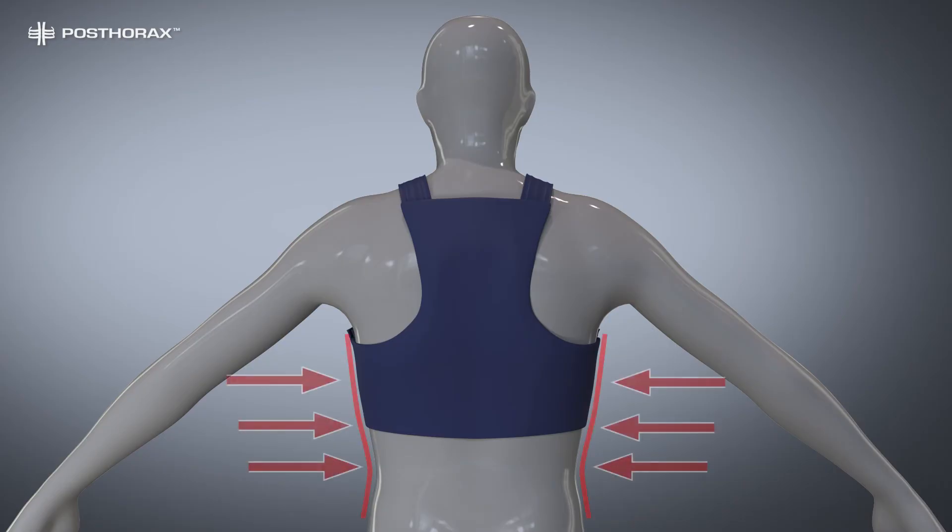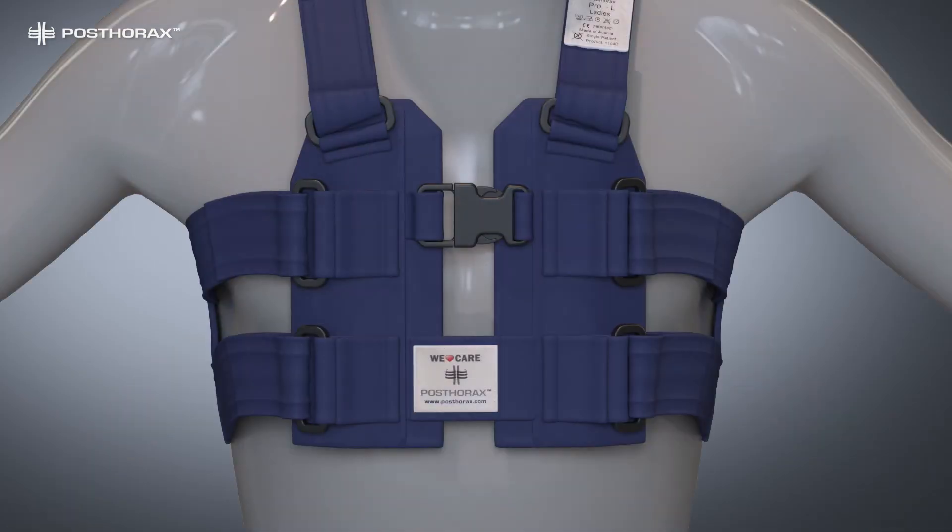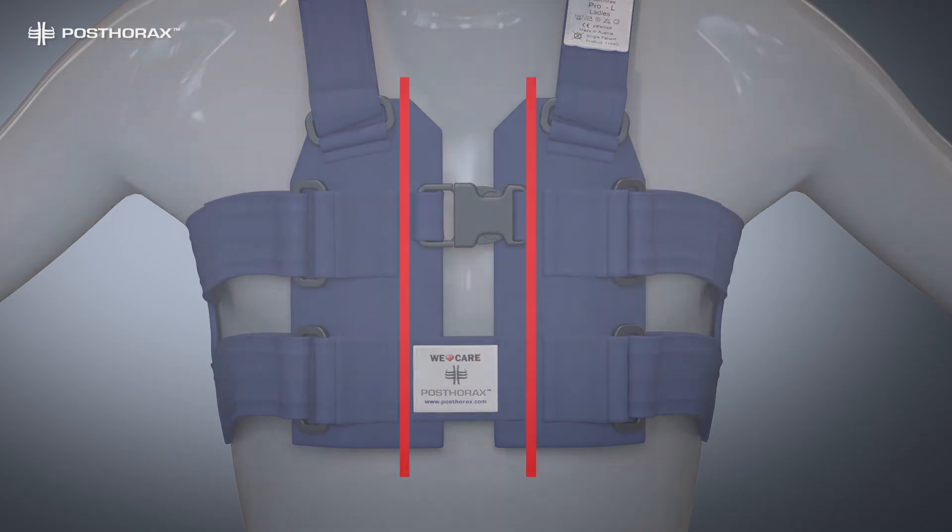The support vest should have a close fit around the body — very important! The back side should be below the shoulder blades. The support pads to the left and right of the sternum fracture should be parallel and exert slight pressure from the front.